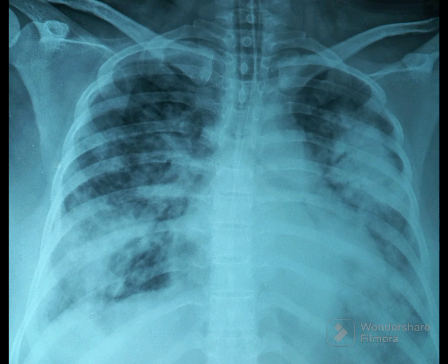The densely consolidated area appears white as the alveoli are filled with inflammatory exudates. The airway branches appear black because of the presence of air. This typical picture of black air-filled bronchi on a white background of the lung is called an air bronchogram.